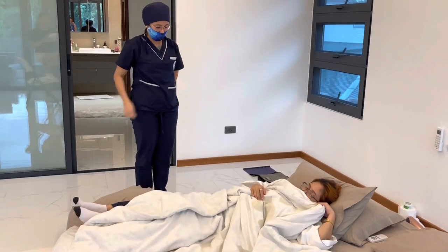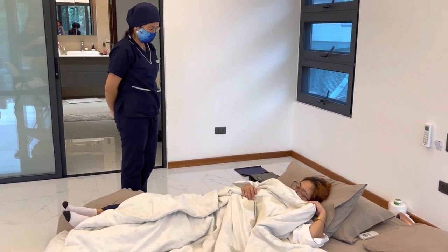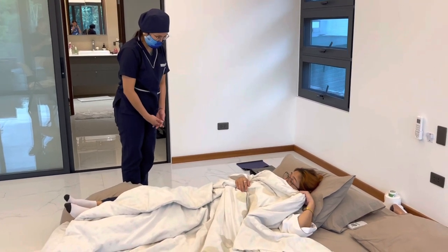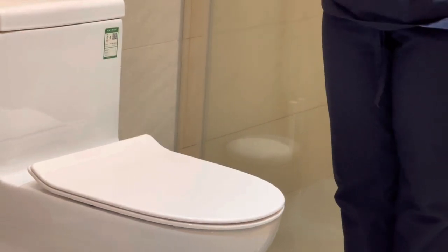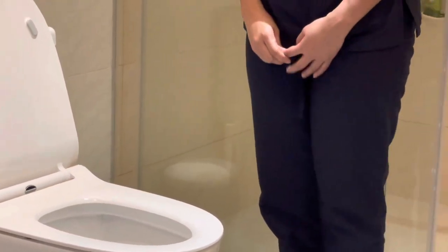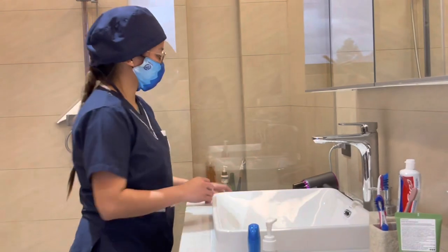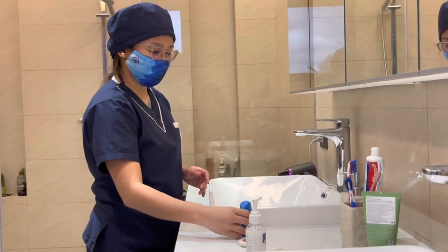After giving and removing the bedpan, we are now going to proceed with collecting a stool specimen. After confirming the doctor's order, explain to the patient the need for a stool specimen for analysis. Is that okay, ma'am? Next, I will prepare all materials and equipment that I will be needing throughout the procedure. We have the commode, ball pen, disposable gloves, and specimen bottle.